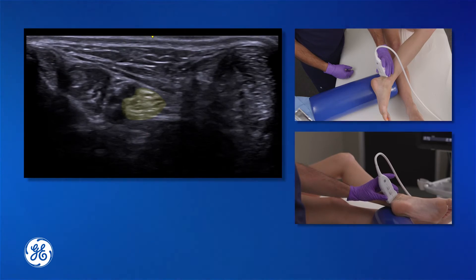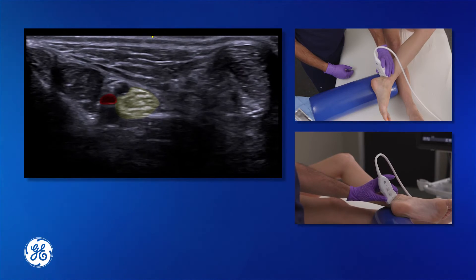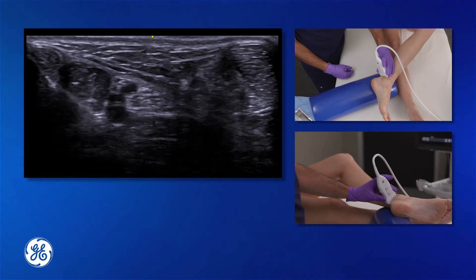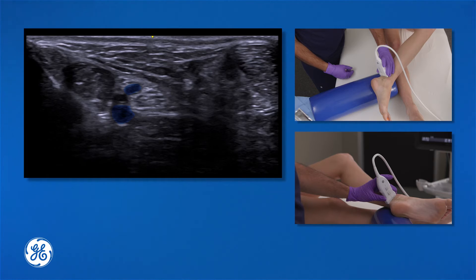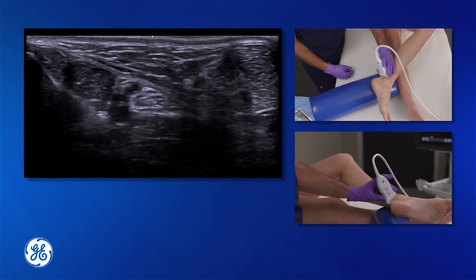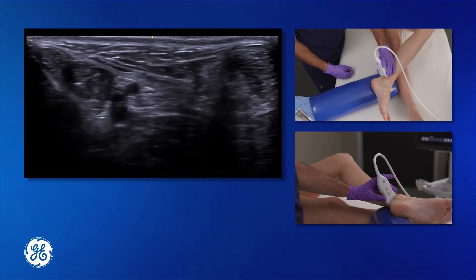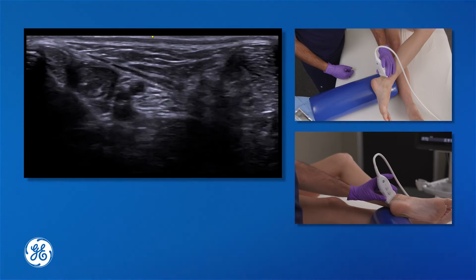This is often found next to the posterior tibial arteries as visualized on the screen. There are also veins in this location, and those can be compressed with light pressure to allow for easier location of the nerve and easier blocking with the needle.